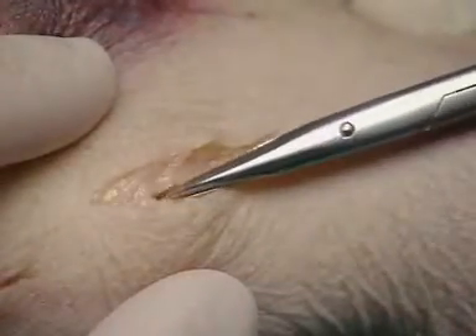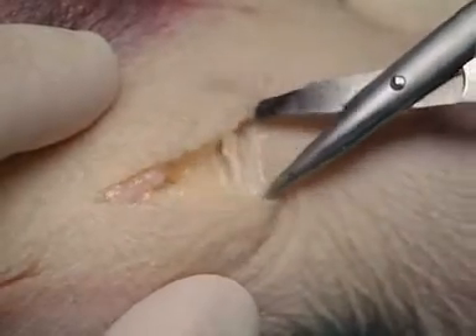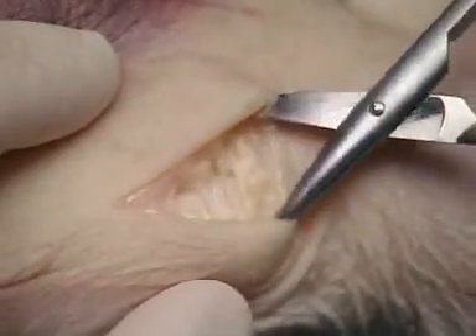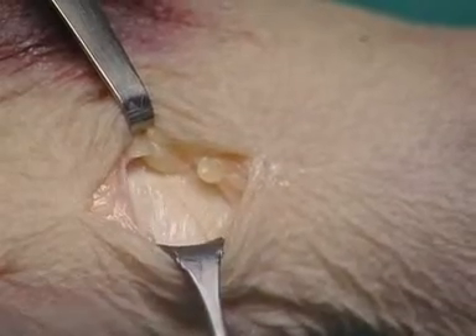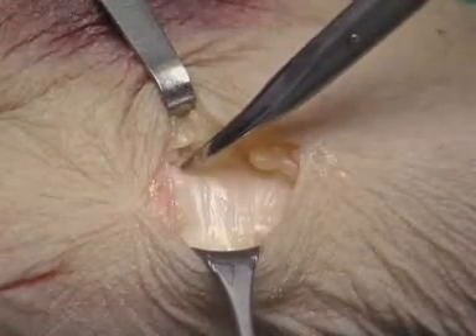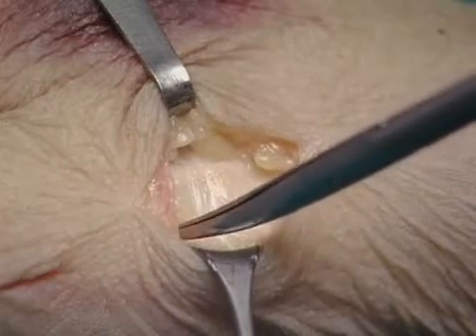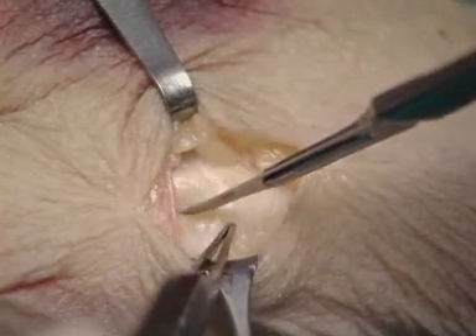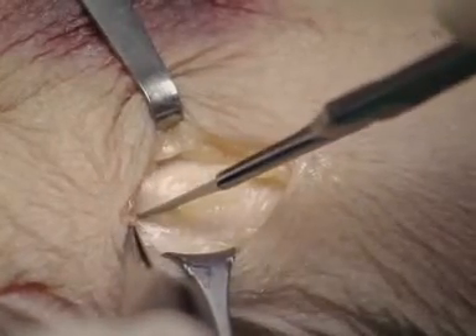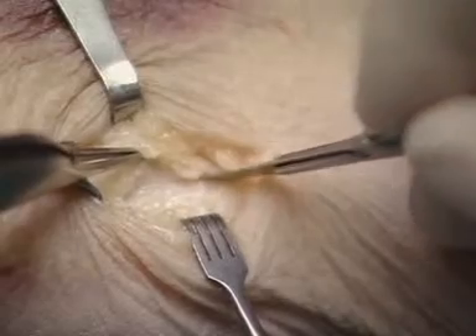The subcutaneous tissue is opened bluntly with the scissors to protect the branches of the radial sensory nerve. Blunt hooks are inserted. The extensor pollicis longus tendon and the extensor pollicis brevis tendon are identified. The fascial portions running transversely between the tendons are incised longitudinally. The periosteum of the metacarpal is incised in the same direction and retracted.